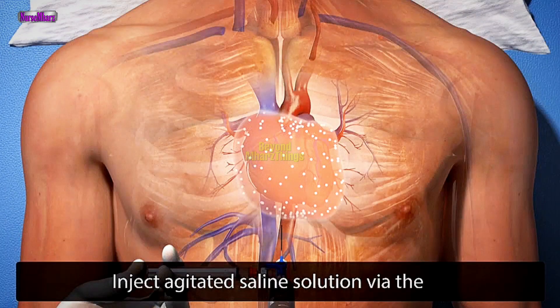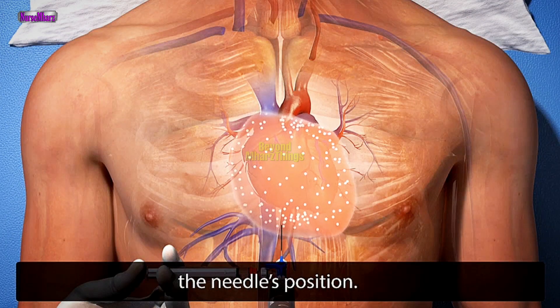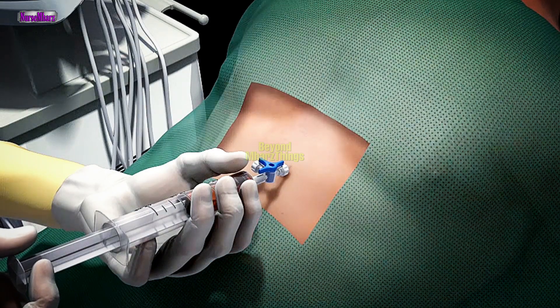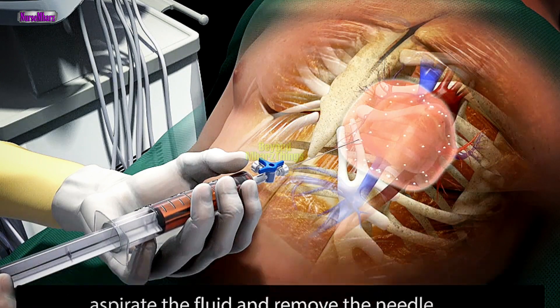Inject agitated saline solution via the side port of the stopcock to confirm the needle's position. When the needle position is confirmed, aspirate the fluid and remove the needle.